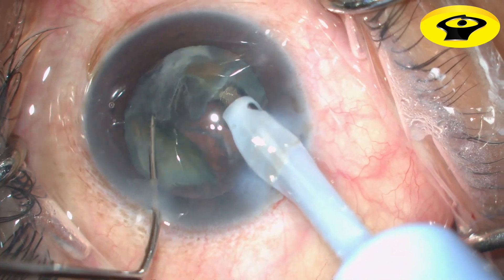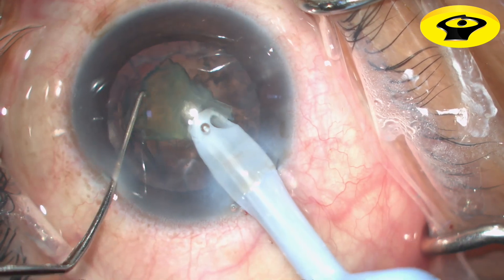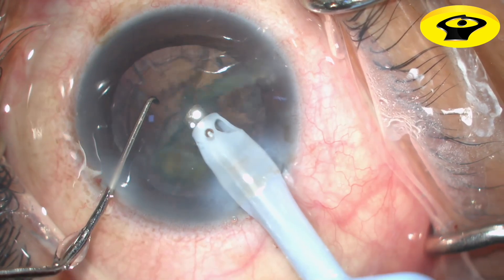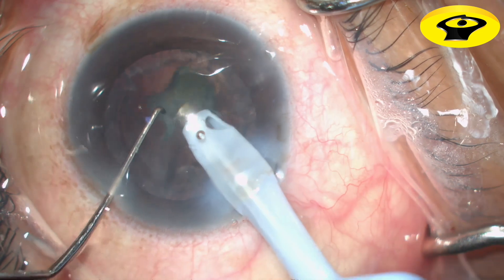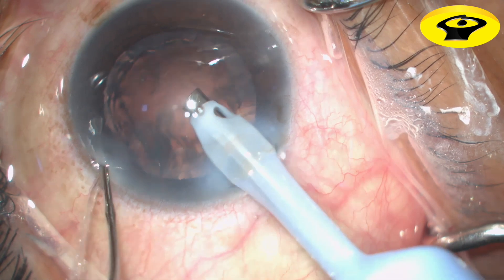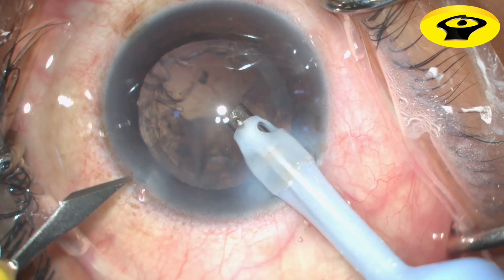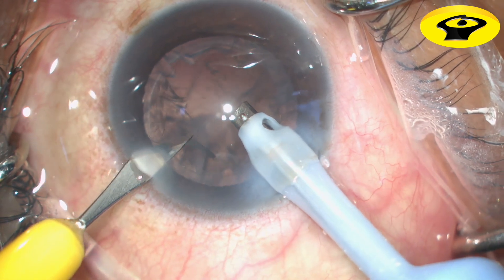Once all the nuclear quadrants are emulsified, switch to phaco 3 or the epinucleus mode with moderate flow and vacuum and low power to emulsify the nuclear sheet. This provides maximal control of the chamber volume and depth and protects the posterior capsule at the conclusion of the procedure.